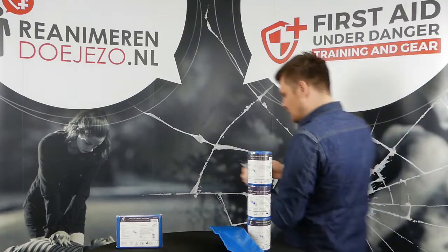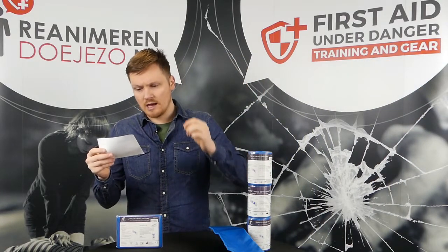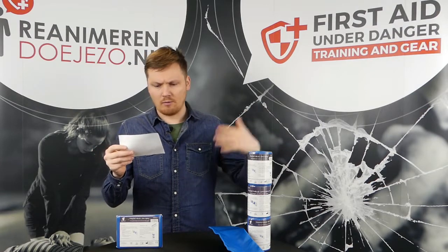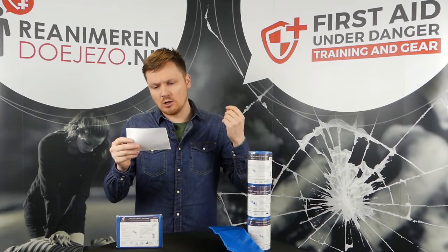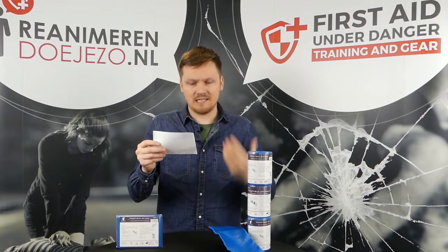As marked on it: it's waterproof, latex free, lightweight and compact, reusable, and can be secured in place with tape or a bandage of choice. It has closed cell foam, which means you can simply clean it up and disinfect it.